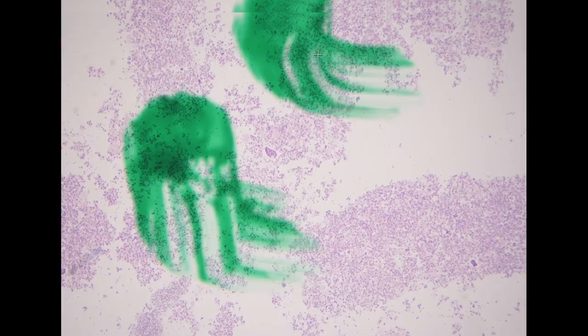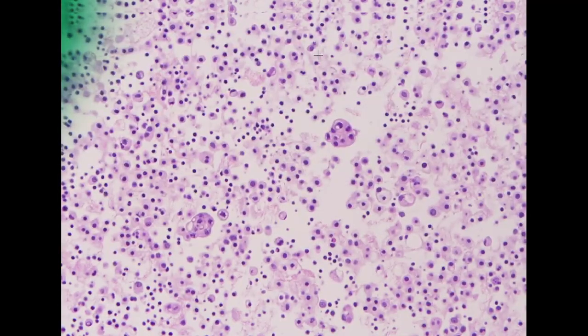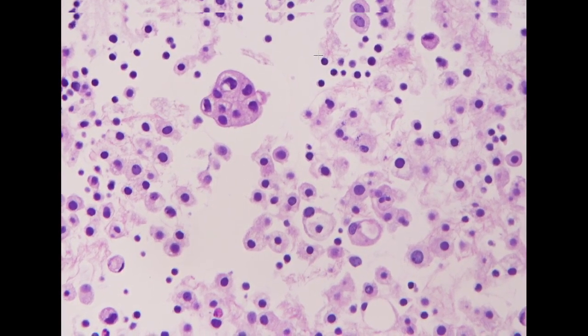However, in the cell block preparation, we do identify a few more clusters of cells with a glandular arrangement and with a traction artifact.